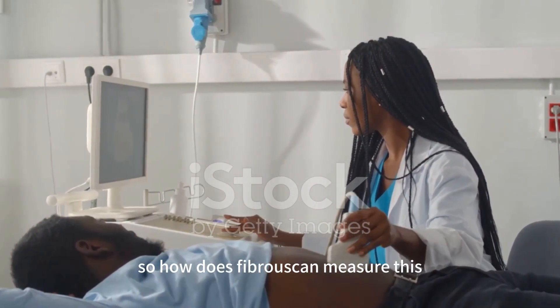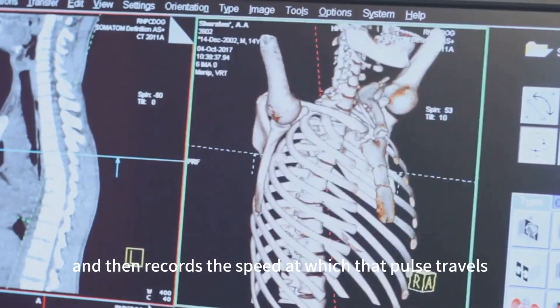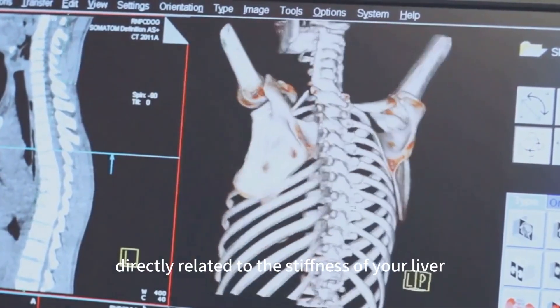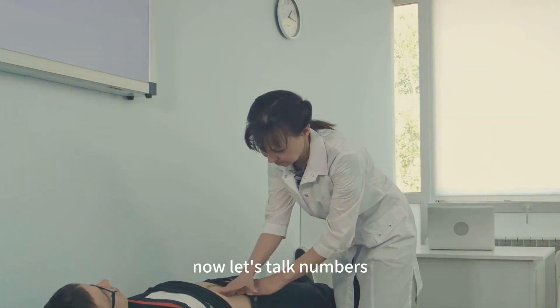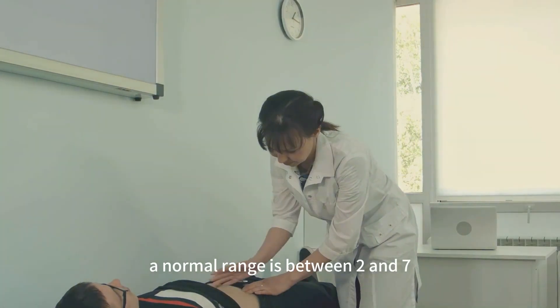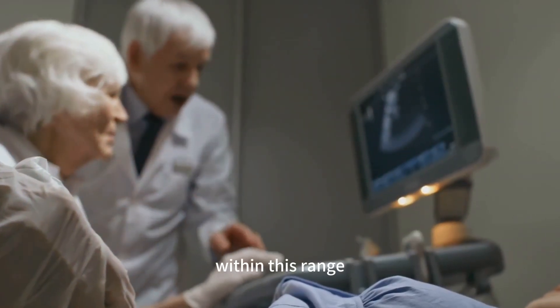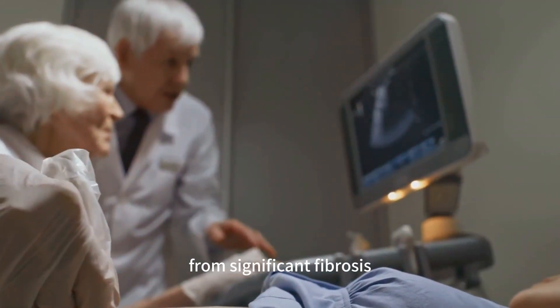So, how does FibroScan measure this? It sends a pulse of energy through your liver and then records the speed at which that pulse travels. This speed is directly related to the stiffness of your liver — the faster the wave travels, the stiffer the liver, and vice versa. When it comes to liver stiffness, a normal range is between 2 and 7 kilopascals, or kPa. If your FibroScan results show a number within this range, it suggests that your liver is relatively healthy and free from significant fibrosis.